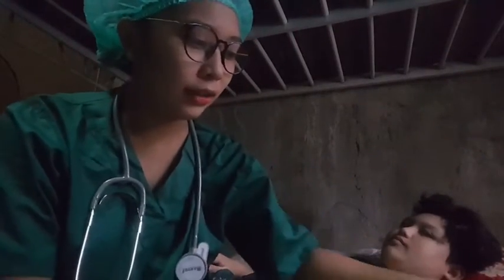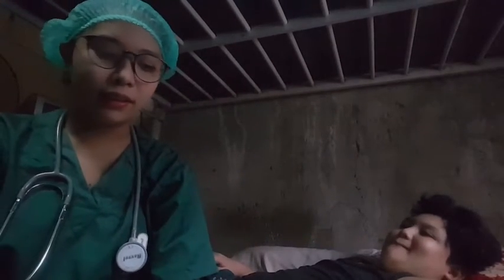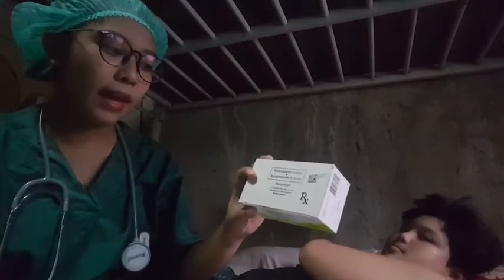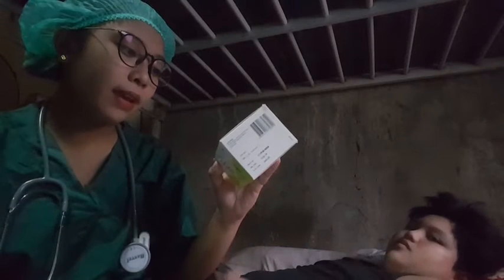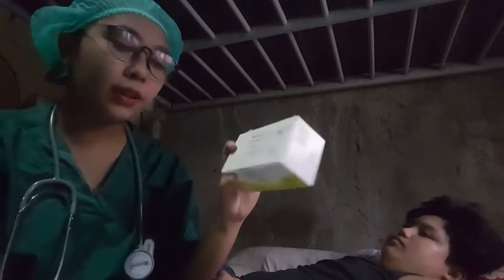I have here the nebulization kit, the nebulizer, the lungs, and a sample of medication. The medication I use is one we had for my mom's tuberculosis. It is ipratropium bromide, 500 mcg per 2.5 milliliter solution for nebulization.